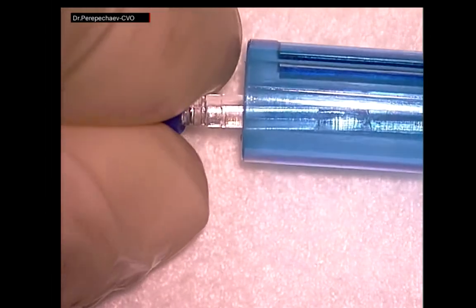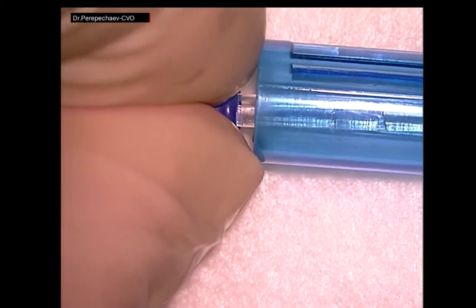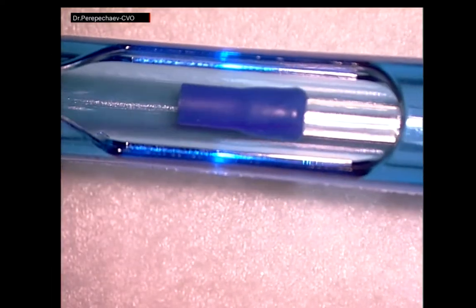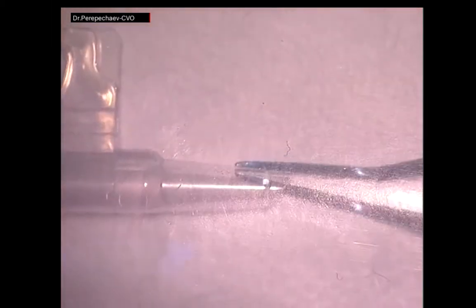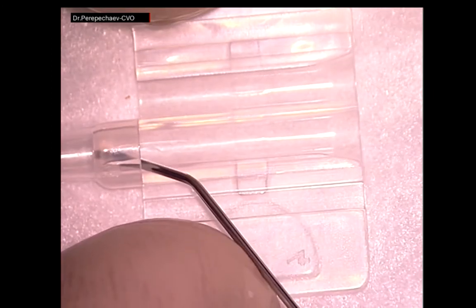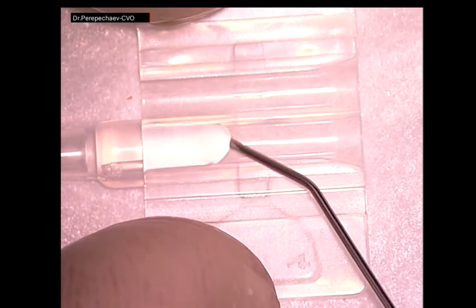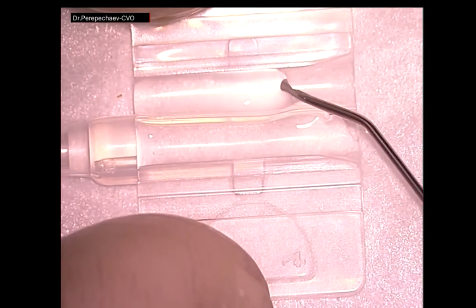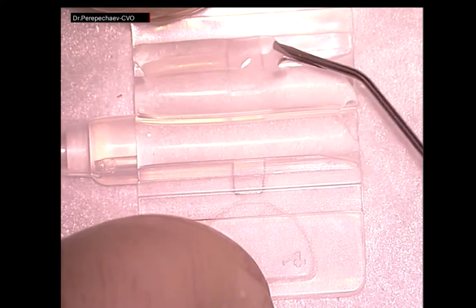We also need to prepare the injection and cartridge for operation. First, they take out the silicone tip and carefully put it on the plunger of the injection. OK, injection is ready to use. Then we take out the cartridge and fill it well with viscoelastic solution. OK, cartridge is ready to use.